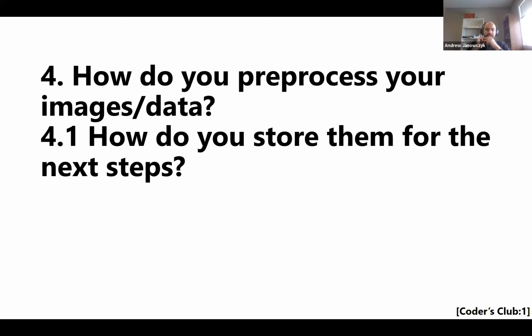So I think we take a slightly different approach in that most of the time, looking at Geert's papers, I think that we have a lot less slides than Geert does. So we have to be a little bit more targeted in how we approach these sort of things. I think what we'll typically do is extract patches, not on the fly, but since we have limited data, it's reasonable to pull out the areas of interest, and we'll put them in some type of high-speed backend storage.